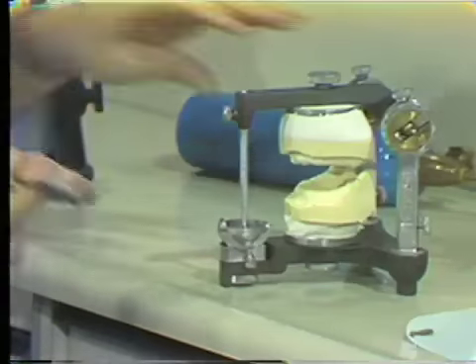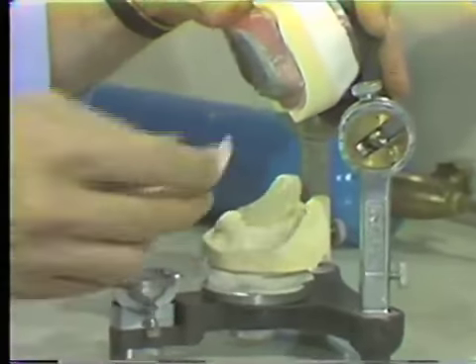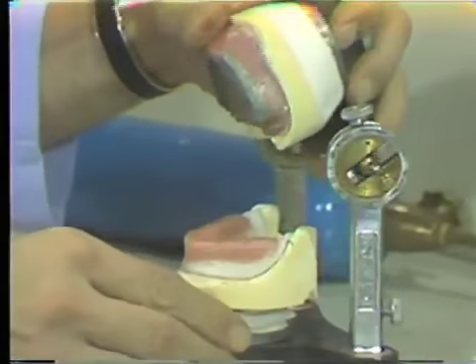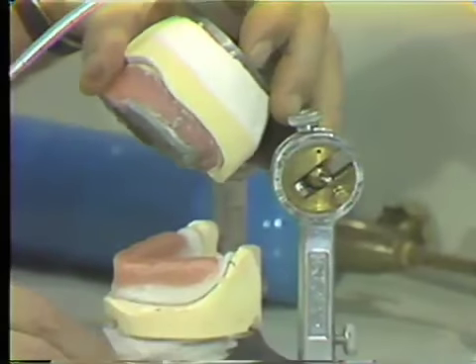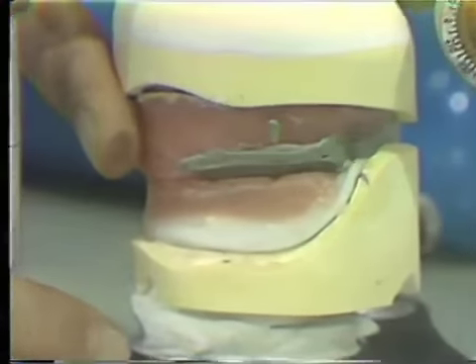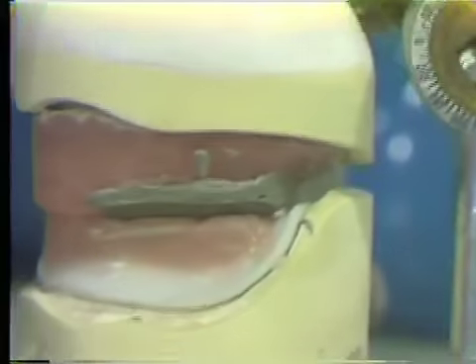We will now place the two rims on the articulator, and you'll note we have made a change in the articulator, that we have loosened the condyles. These screws have been loosened, allowing full movement of the condyles on each side. We now then will close the articulator, and with this loose, it can seek its own positioning until the two wax rims are seated, as you see now.